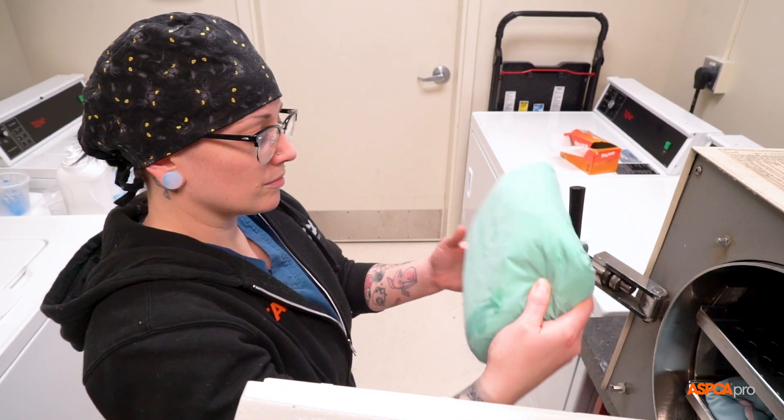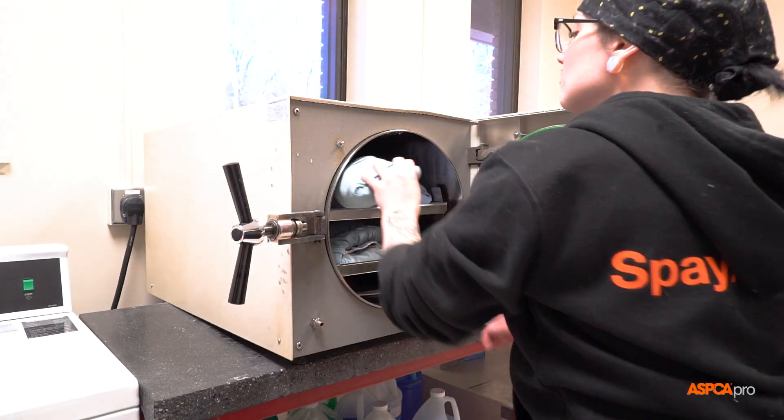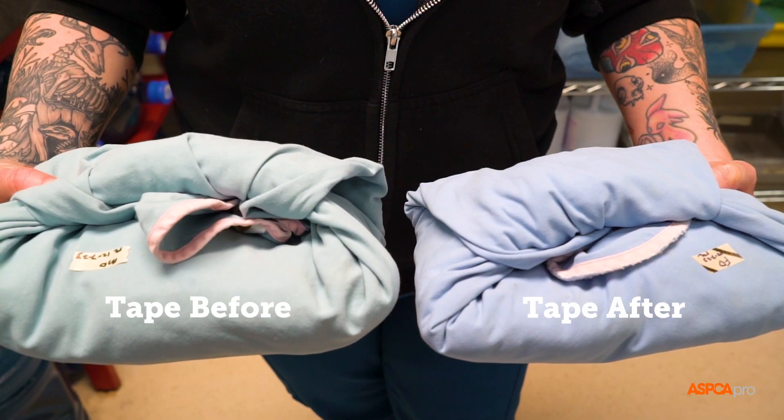The wet material will wick microorganisms from the immediate environment into the interior of the pack, thereby contaminating it.